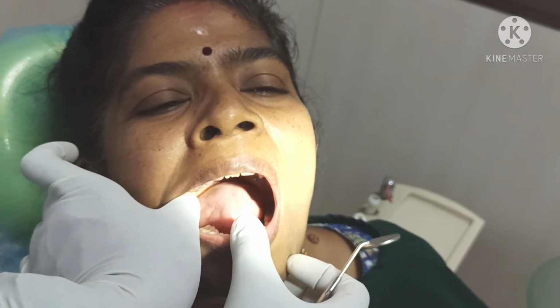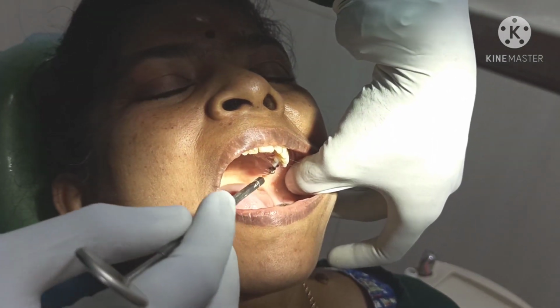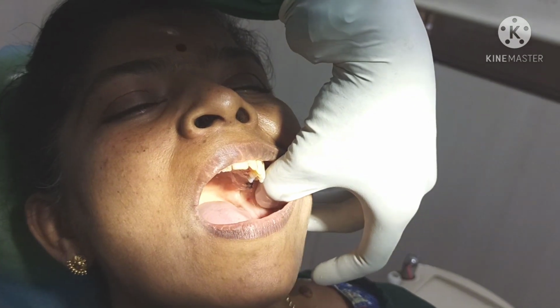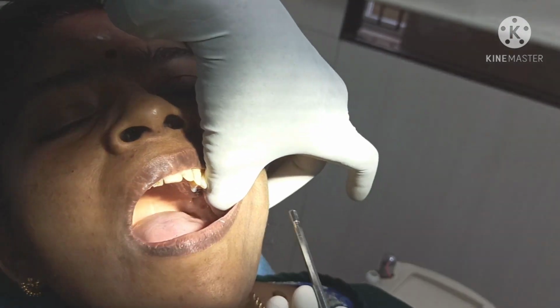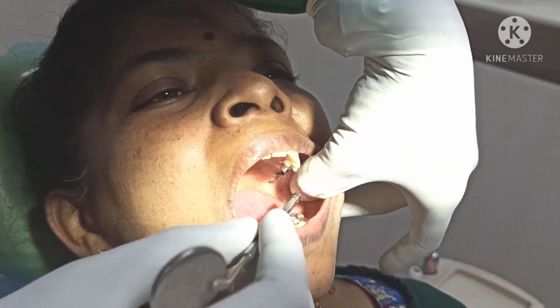So practically I am just holding the mandible with my fingers, holding the ramus now. Now we will get an idea about how much width it is. If you start this for all patients, then you will understand how the width of the ramus varies from patient to patient. So based on the width, you can vary the depth.